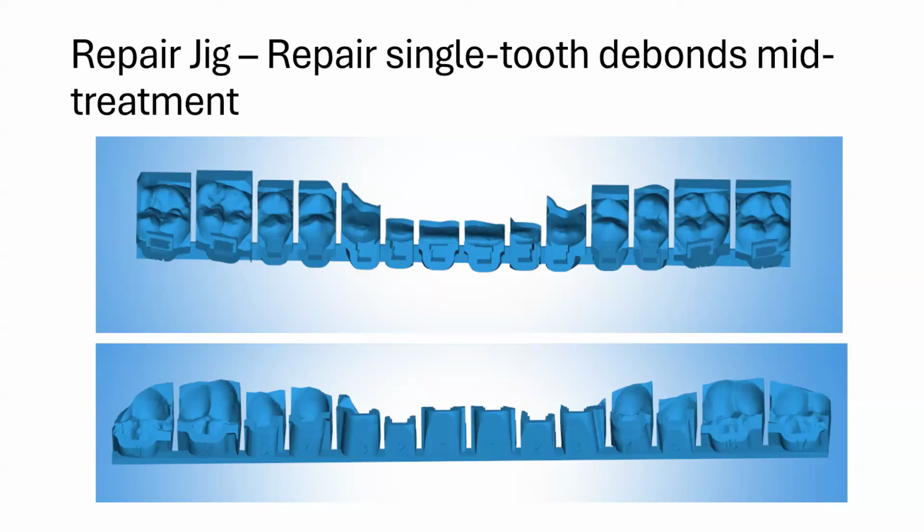So how fast can you flip them? I don't know. It all depends on how quickly the doctor approves the case. Yeah, we typically get a setup back to you within 24 hours. As soon as you approve it, we're printing and shipping within 24 to 48 hours. So it can be quite quick. We book 4 weeks for aligners and 2 weeks for our fixed appliance setups. And if they ever have to reschedule people, it's our aligner people. It's never the brace people.